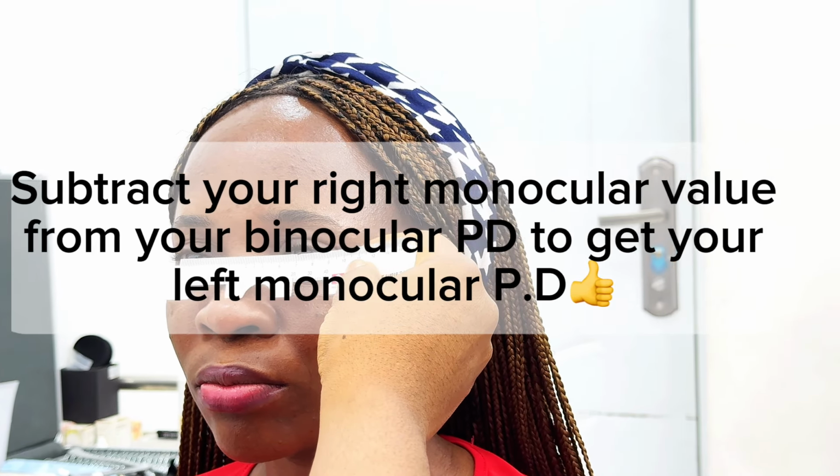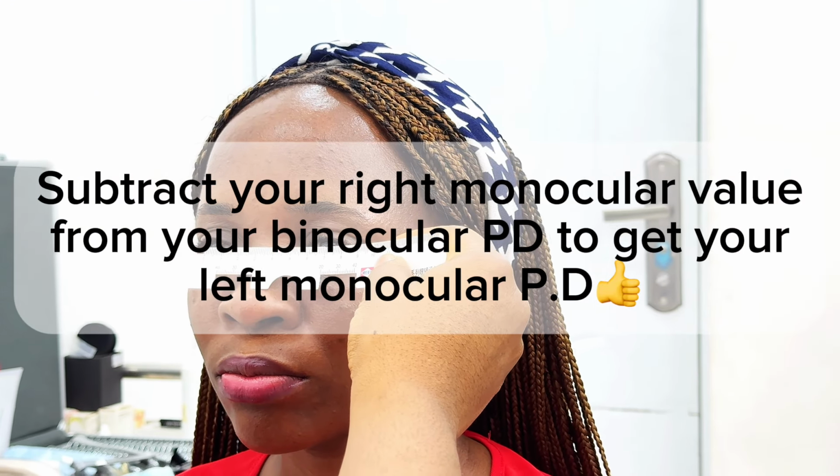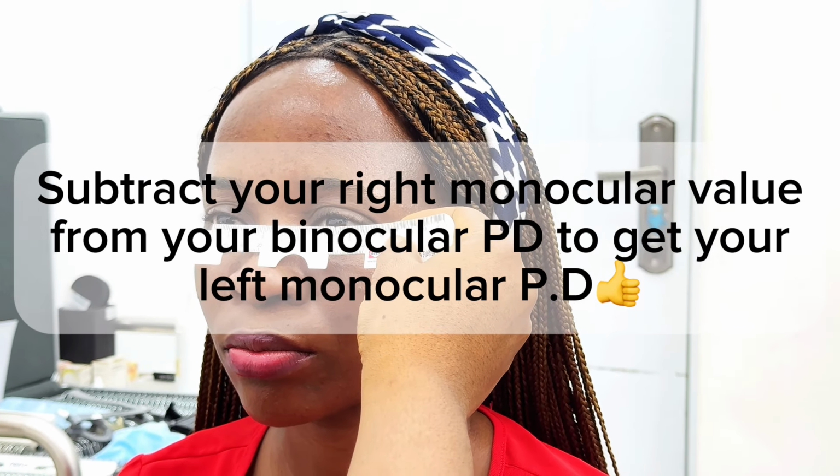Same method. I'm seated 40 cm away from my patient. We're at the same eye level. My patient is looking at my left eye while my right eye is covered, and then I measure from the center of her right pupil to the center of her nose bridge. So that is that about monocular PD measurement.